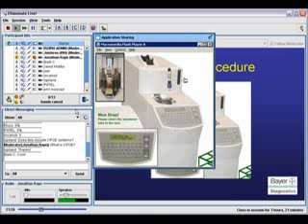So if they actually drop the vacutainer before they get back into the test tube, into the rack, then it actually will. And what will happen is people will then just, the first time, they'll just pick it up and just drop it a lot. But eventually they get the basic idea. And when they actually approach the real device, they're much more comfortable with what they actually have to do. So to make that real hands-on training much more effective.